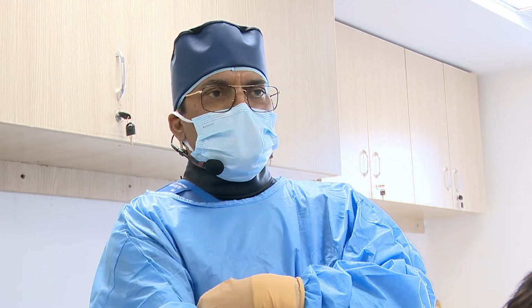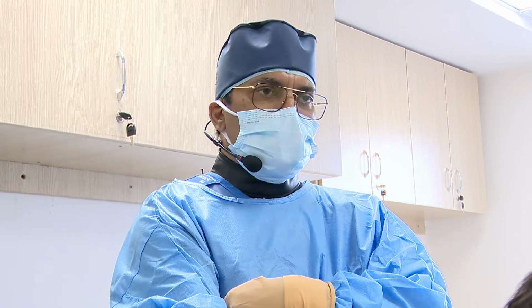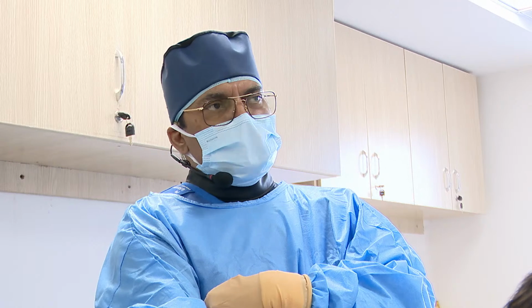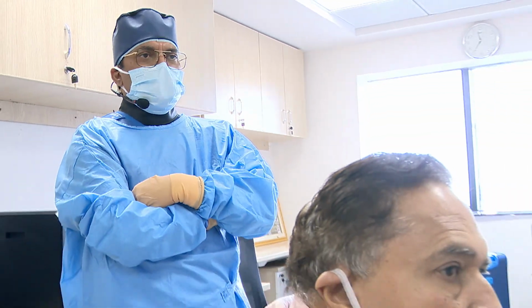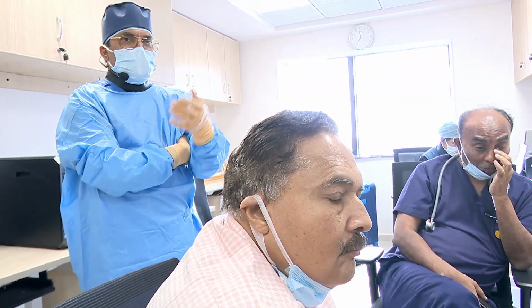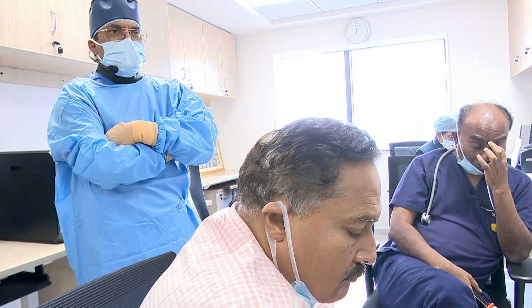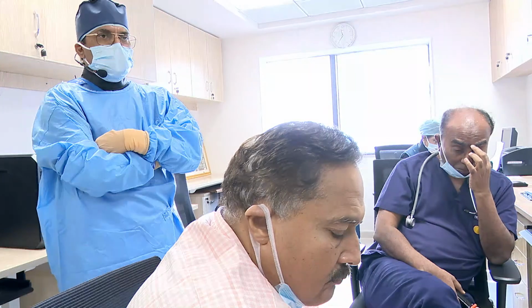After that we will take the opinion of Dr. Vijaykumar Reddy. After that we will assess any need for plaque modification, whether the patient only needs a cutting balloon or rotablation or orbital atherectomy. Once we acquire the image, we will take the opinion. Then, once we do the plaque modification, we will implant the stent.